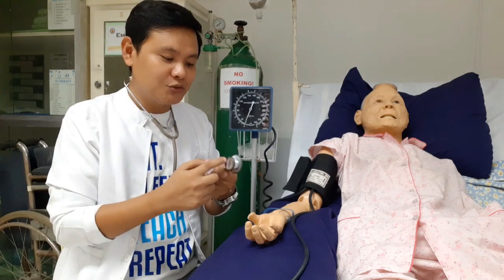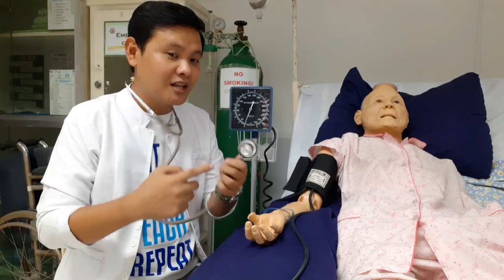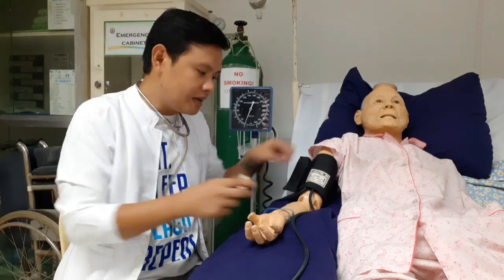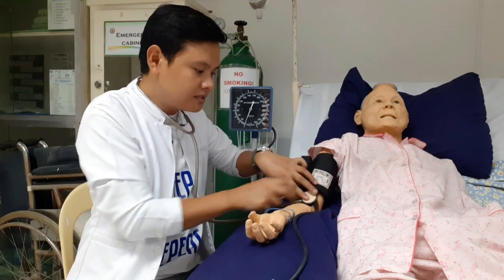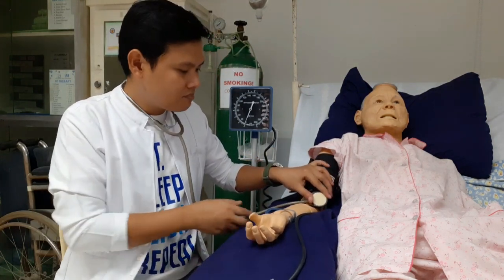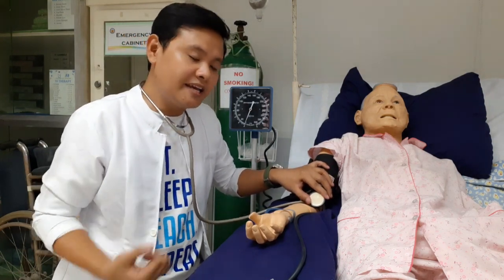So, the sound here is loud, meaning this one is open. The diaphragm is closed, the bell is open. So next, place the bell over the brachial pulse. Hold it like this. Can you see it in the video? Yeah. Hold it like this, and now you have to auscultate the client's blood pressure.